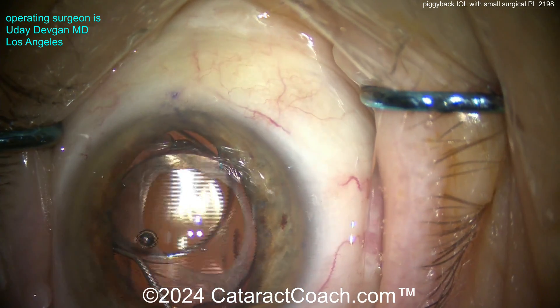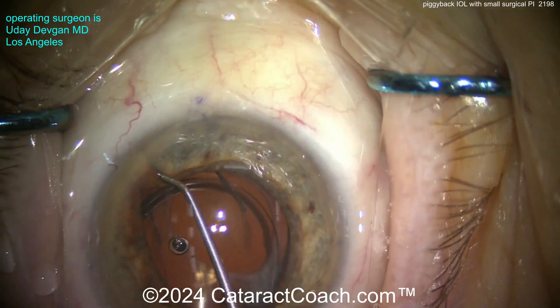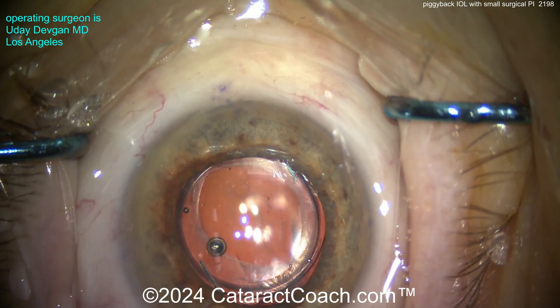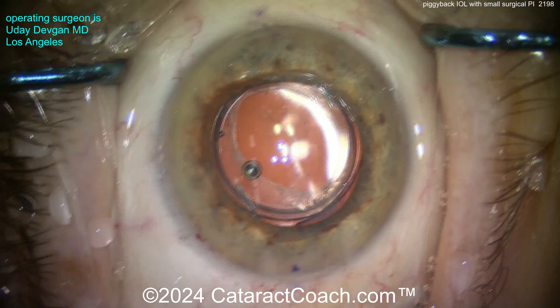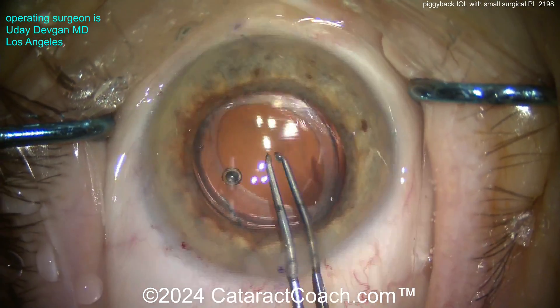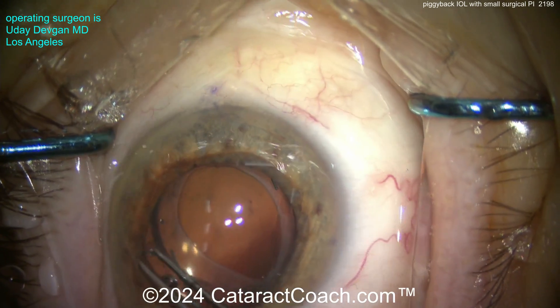We're rotating the lens around, getting both haptics nicely placed in the sulcus. This lens is a Bausch & Lomb Li61AO. I'm just using the chopper to keep the lens centered as we bring down the iris. You want to make sure that the haptic is not pushing up against the underside of the iris.